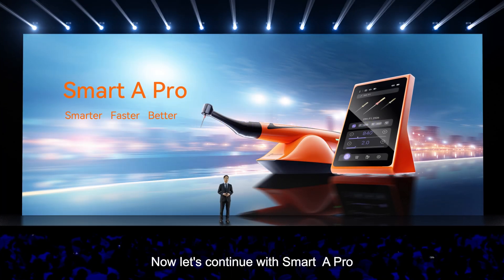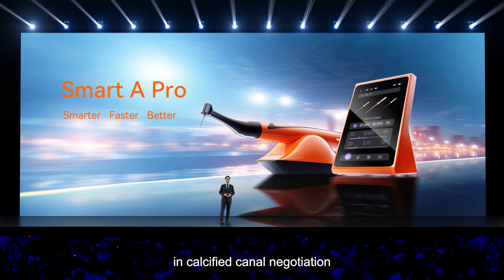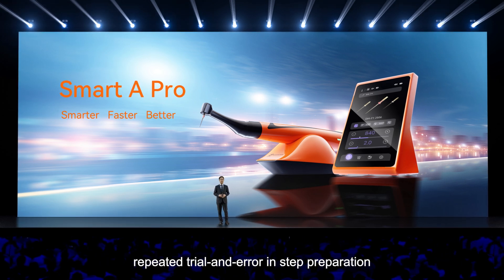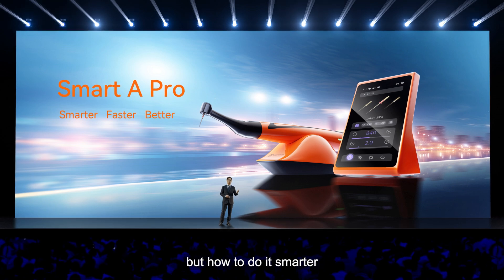Now, let's continue with Smart A Pro, the solution to hesitations in calcified canal negotiations and repeated trial and error in step preparations. Smart A Pro is not about how to do it, but how to do it smarter.